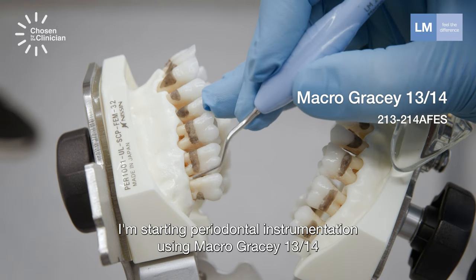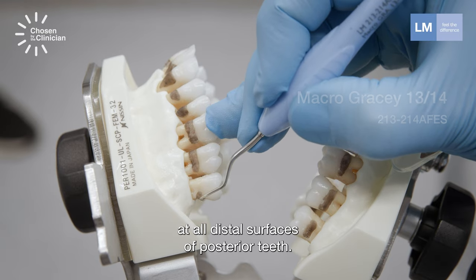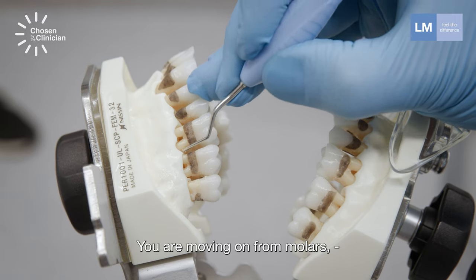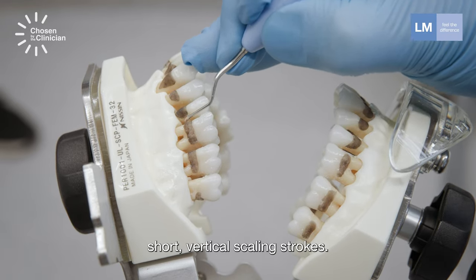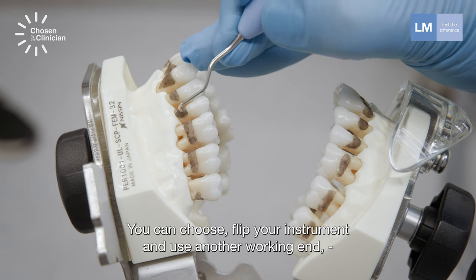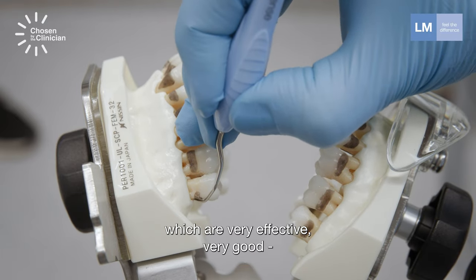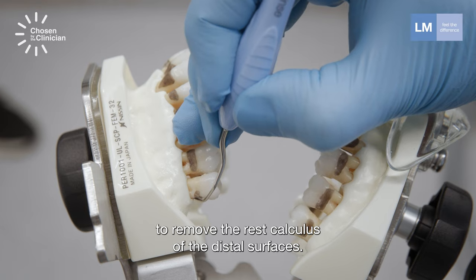I'm starting periodontal instrumentation using macro Gracey 13-14 at all distal surfaces of posterior teeth, moving from molars to premolars, making very nice short vertical scaling strokes. You can choose to flip your instrument and use the other working end, changing your finger rest position, and making some horizontal strokes, which are very effective to remove the remaining calculus on the distal surfaces.